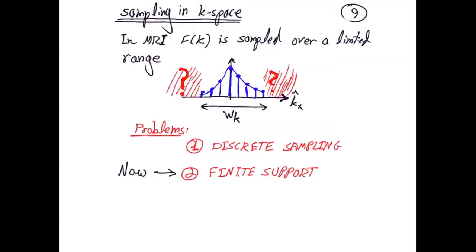Okay, so broad question, but what's the typical wiggle room or realistic criteria for sampling? Because I imagine you wouldn't want to be at the bare minimum Nyquist, right? Just in case it gets cut off. No, actually. Or can you? Well, no. You can see exactly. What you do is you do scout scans.